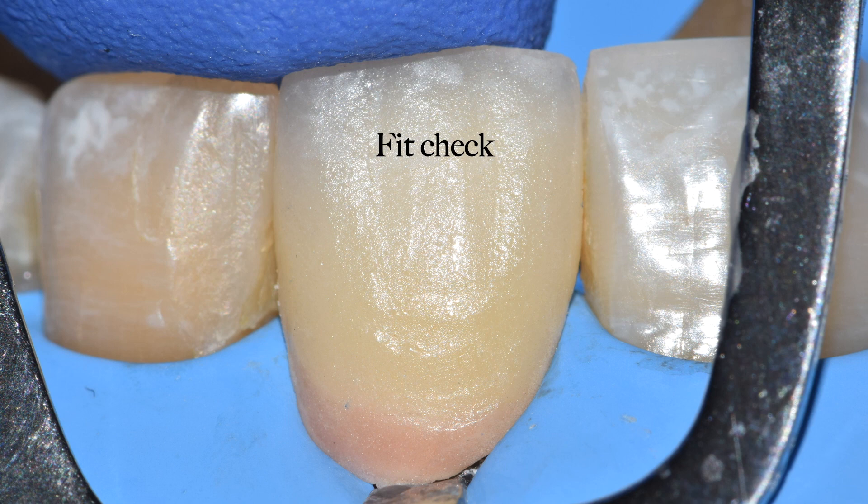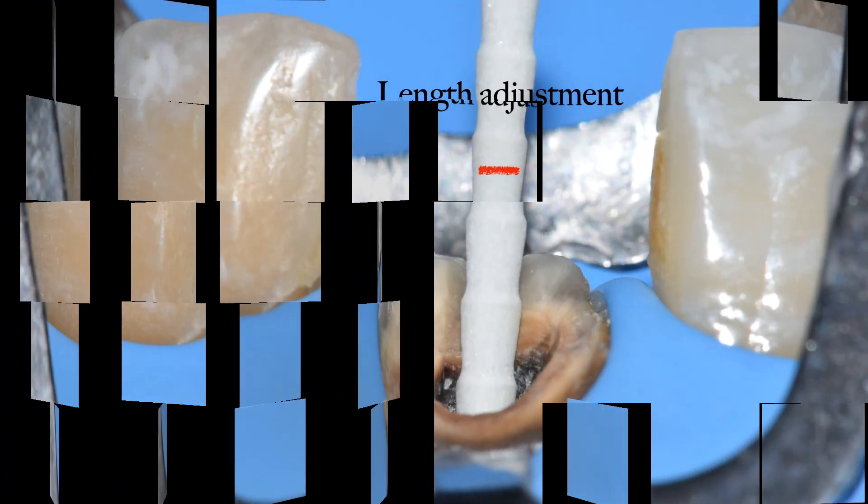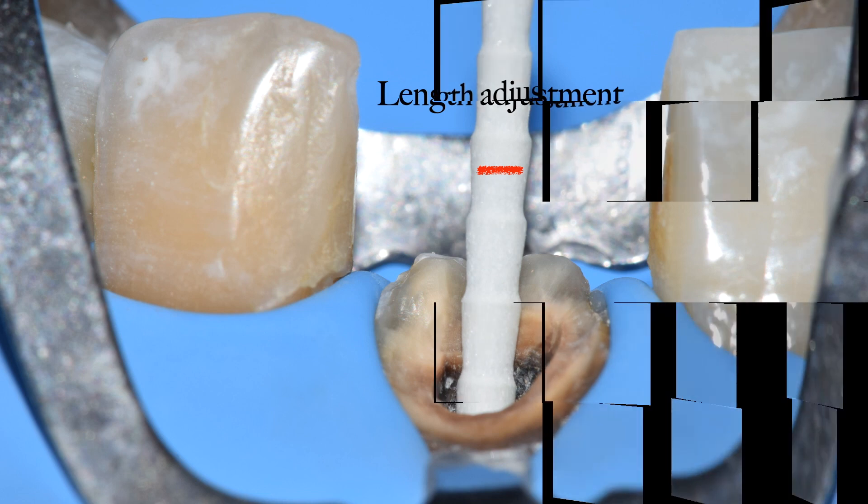After caries has been removed and the surrounding structures have been cleaned well, the next step is to do a post-core. Any post has a specific length. If I am not cutting the post and am directly luting it, there is a possibility that the post might interfere with the crown placement. Therefore, you need to cut the post before you start with your post-core. As per the length of the crown, the post has been cut approximately.